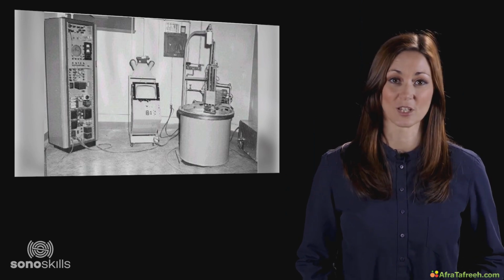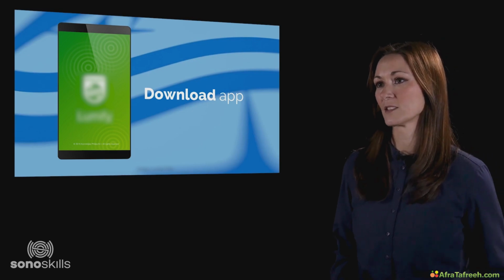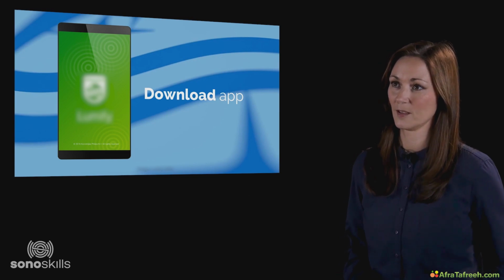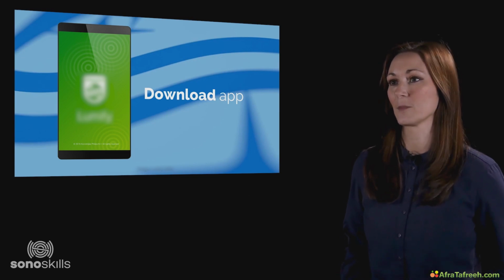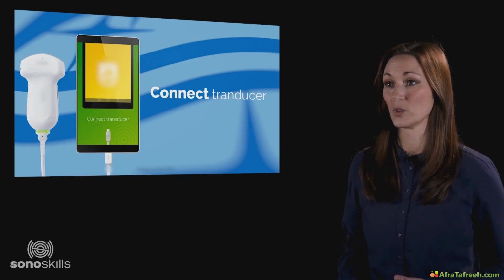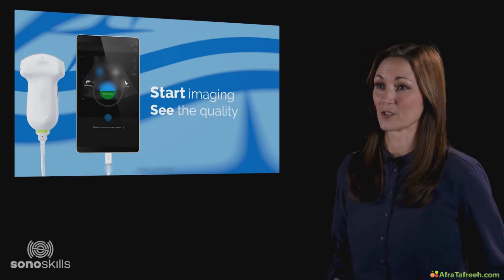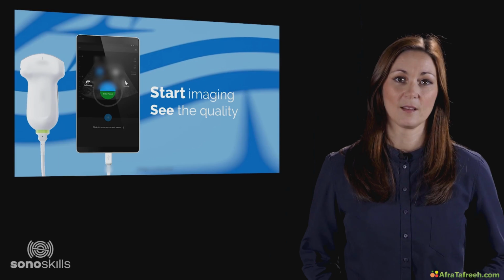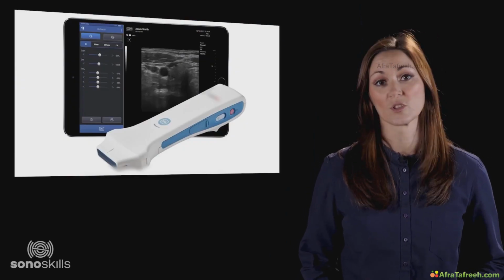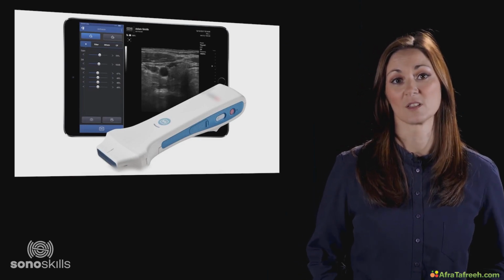Fortunately, ultrasound technology is rapidly advancing and being refined. This has resulted in the recent development of smartphones and tablets that can be used for ultrasound assessment. It's just a matter of downloading an app to your device, connecting a transducer to your device, which contains all electronics necessary for ultrasound, and then you can start scanning your patient. Here you can see that there are also developments in wireless transducers, not only for the smartphone solutions, but already existing for the systems currently used in clinical practice.